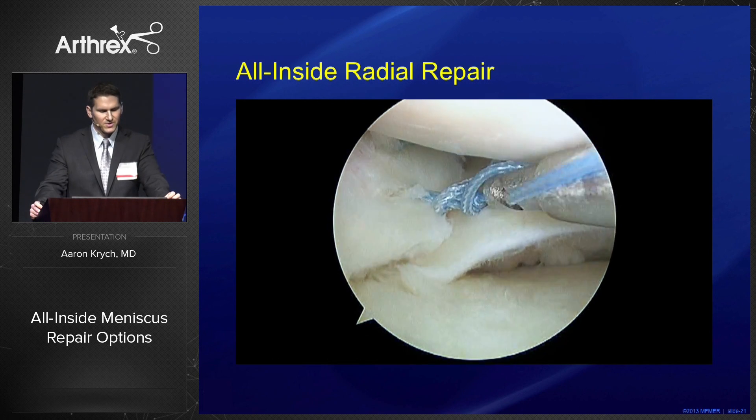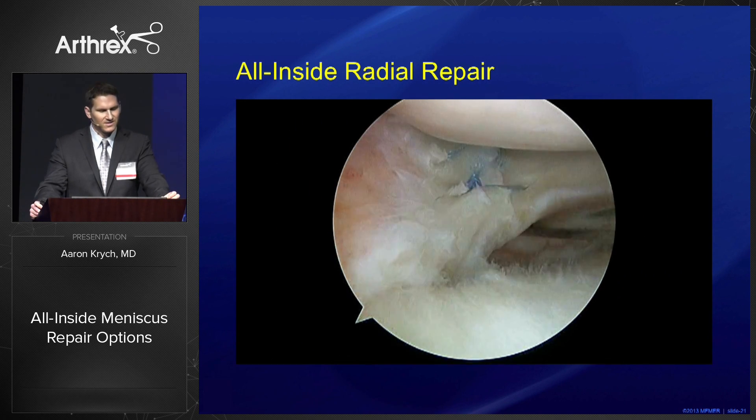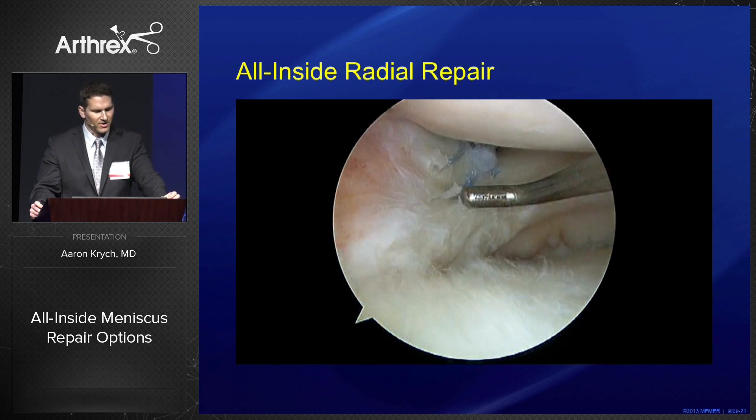That knot will eventually go to our first tissue penetration, and then we know that we're fully compressed. Here we get a nice robust repair that's very satisfying.